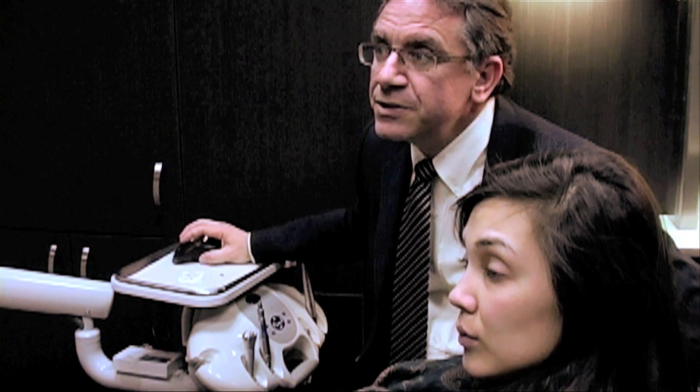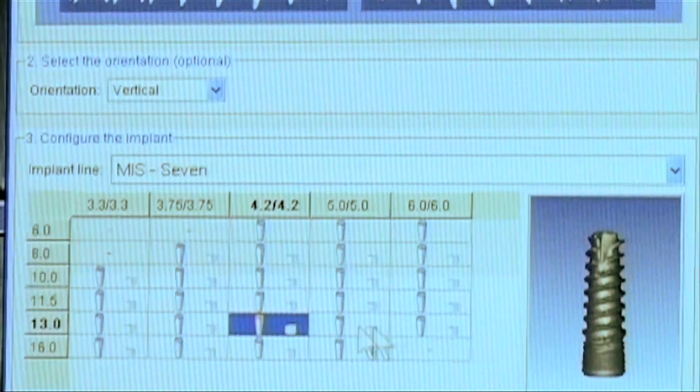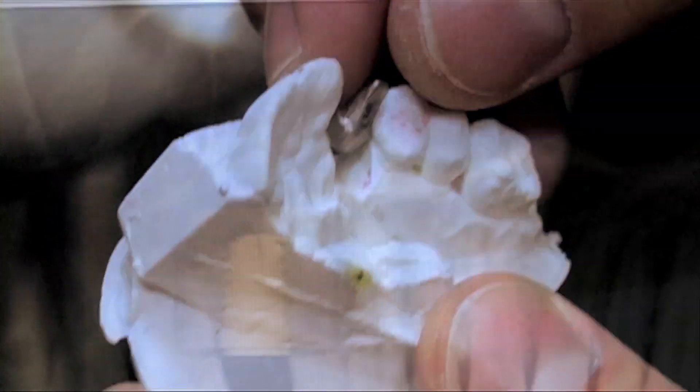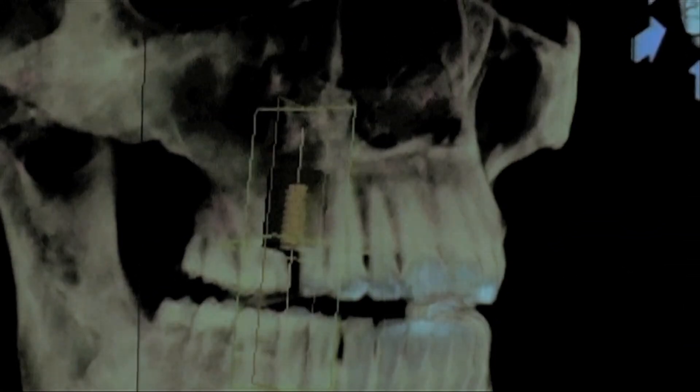What we see on the screen is the actual implant itself. I've determined the size and diameter of the implant, and we're going to create an abutment that's going to literally screw into the implant. As we can see, the implant fits perfectly. We know in advance the size and design of the implant we're going to use.